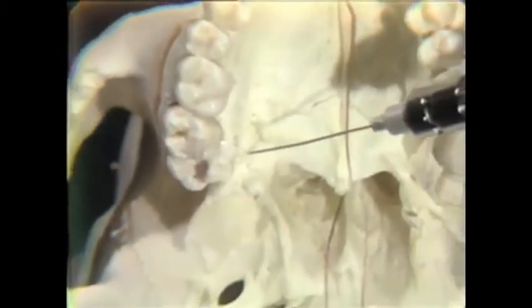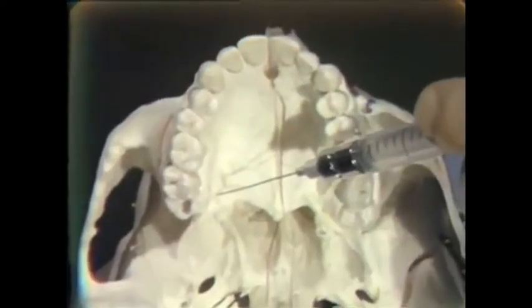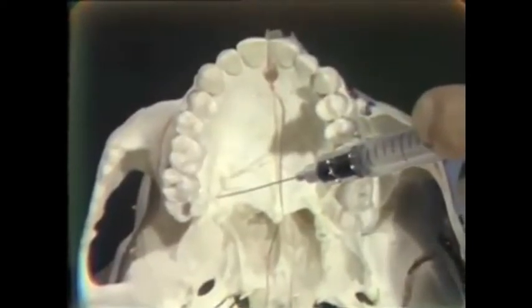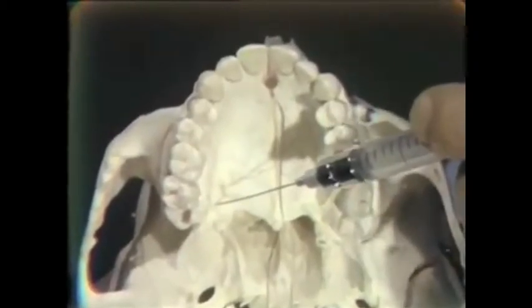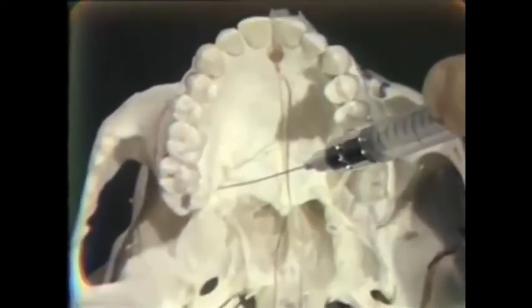And we deposit just a few drops of solution after aspirating, and you will find again that with these palatal soft tissues, due to their fibrous nature, it is difficult to expel solution from the syringe into the tissues, and you have to bring to bear quite a little pressure on the plunger to do so. You will normally see the tissues blanch in this area due to the vasoconstrictor in the solution, and as you observe this, you will know that you have got a few drops at least of solution out into the tissues here just anterior to the foramen. Ideally from a quarter to a half cc of solution, if you can, injected at this site.